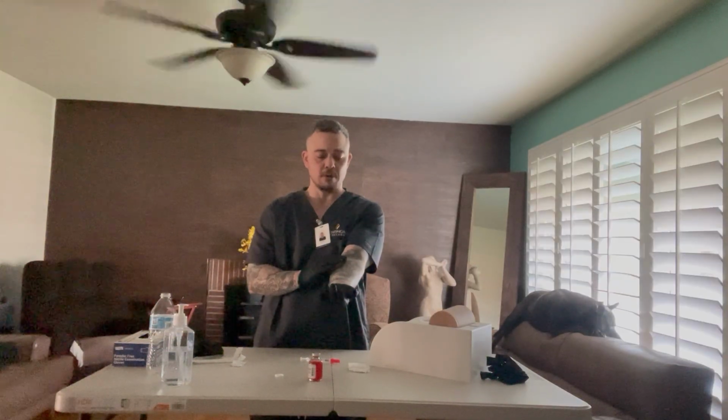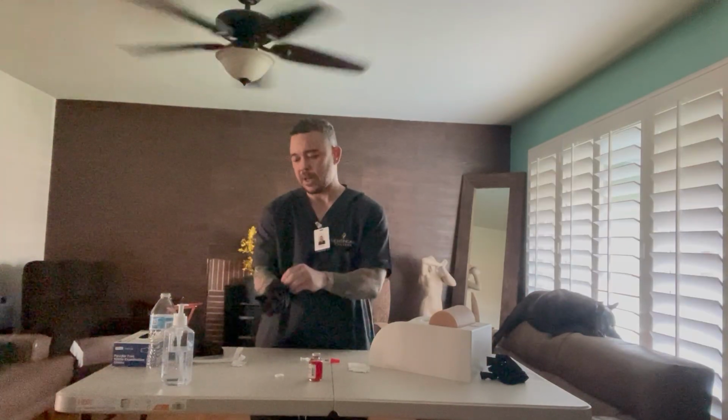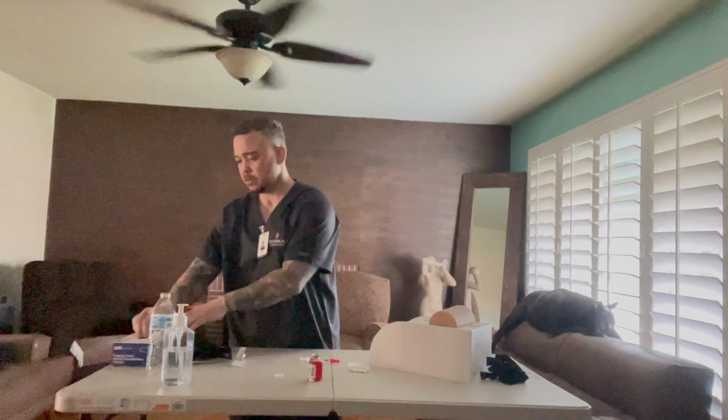that there's no discoloration, no redness, no inflammation, and if there is, I'm going to switch arms to check for the same. Once it looks good, I'm going to palpate to make sure that it feels good and looks good. And once that's done, I'm going to change gloves one last time. Hand hygiene.